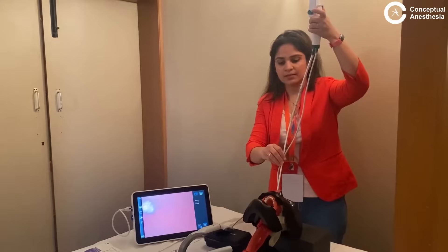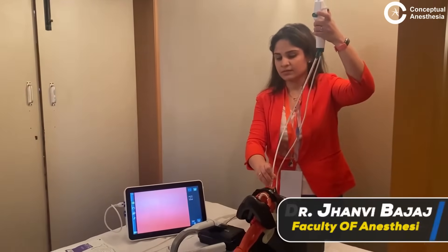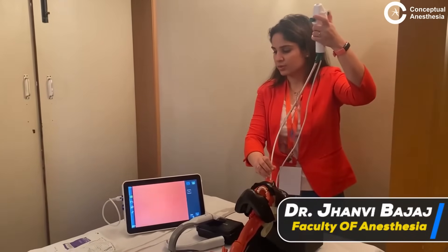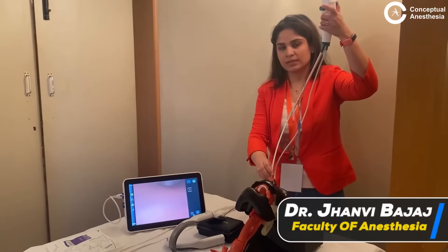I pass the scope and you can see the structures in the video camera. As I go in, what you can see over here is that there is nothing but nasal mucosa.